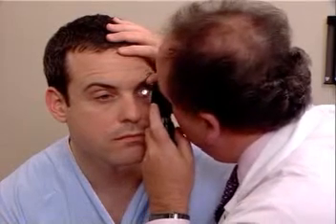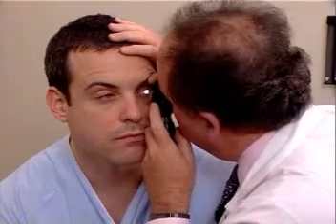The optic disc is well visualized, as is the vasculature. Looking superior nasal, inferior temporal, superior temporal. And Mr. Johnson, look at the light, please.